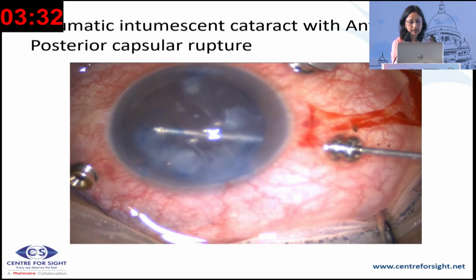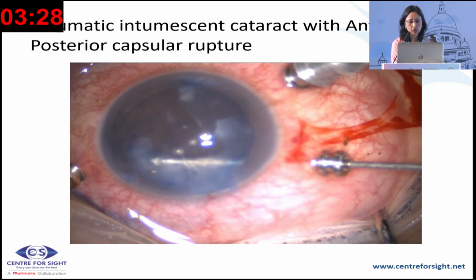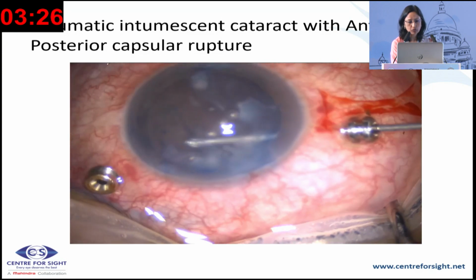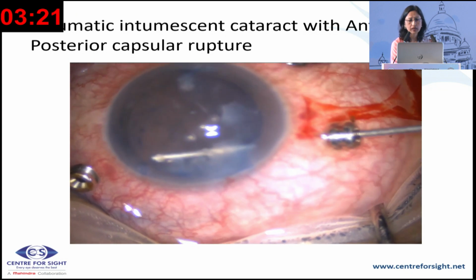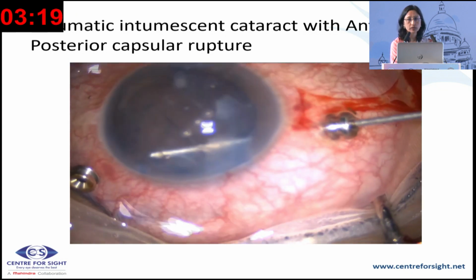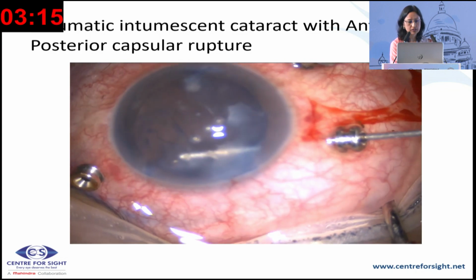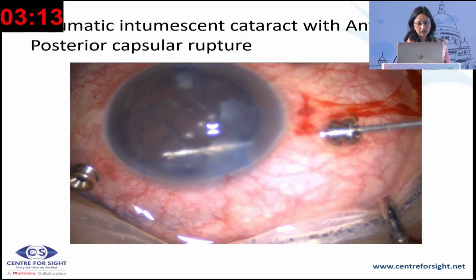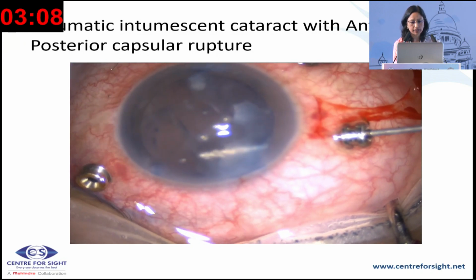We clear the area of the vitreous, then switch to the aspiration mode and slowly remove the loose prolapsed vitreous and the cortical matter. In this way, there is no traction on the retina, no extension of the PCR, and we are able to remove the vitreous and the cortical matter without damaging the posterior or anterior capsule.